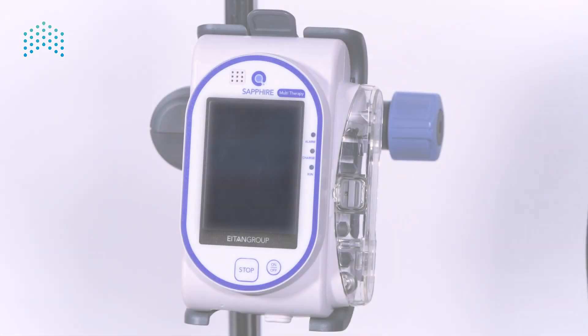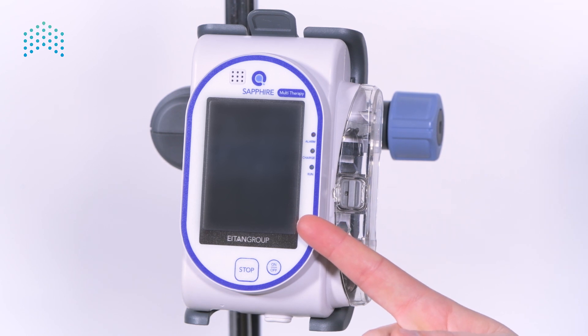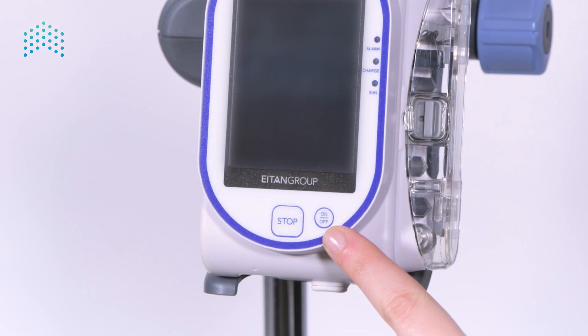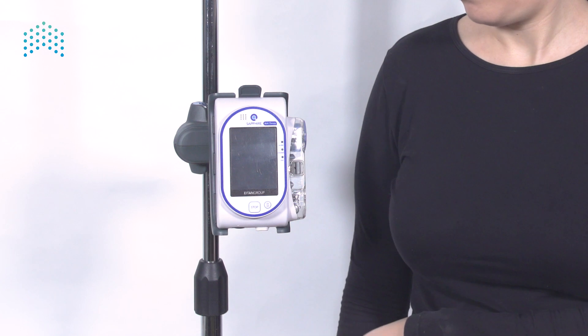The sapphire pump — the most prominent component of the sapphire pump is its colorful touchscreen, through which most of the operations are done. Below the touchscreen are two hard keys: the on/off key, used to power up the pump or shut it down, and the stop key, used for stopping any running infusion immediately.